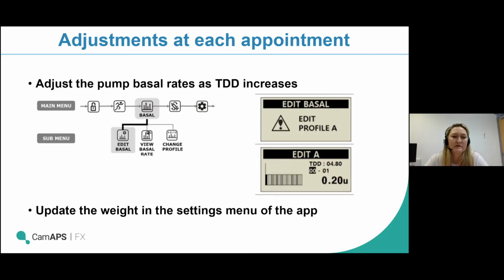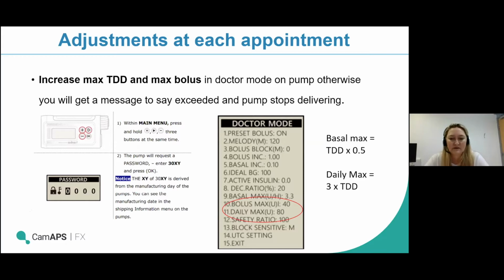So that's really important. I'm not going to go through this in detail, but we often get asked how you adjust those settings. As Candice said, this session's recorded, so this slide will be available for you to look back at if you can't remember where to change the basals, or, on the next slide, the settings in the doctor's mode. It's all on that slide for you, and you can always have a look back as a point of reference.